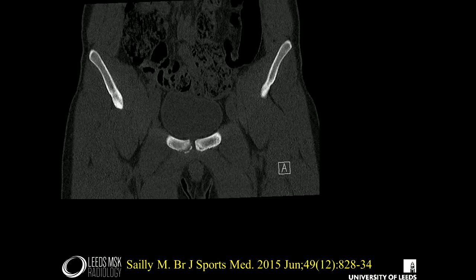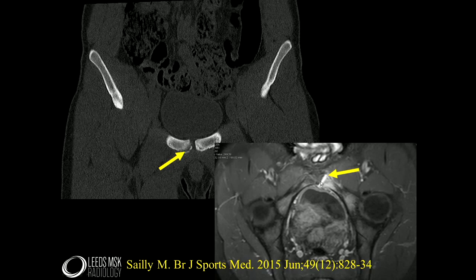It's been written up recently that you can get an apophysitis. On CT scan, on the left we have a normal apophysis closely applied to the pubis in a young 16-year-old, and on the right you can see widening of the apophysis with ill definition — this was an acute stress reaction through the apophysis itself rather than an avulsion. Here's the corresponding MRI in a different player. You can see the normal apophysis on the right, and on the left the intense signal reaction across the physeal region with some reactive change in the body itself — again, good prognosis.